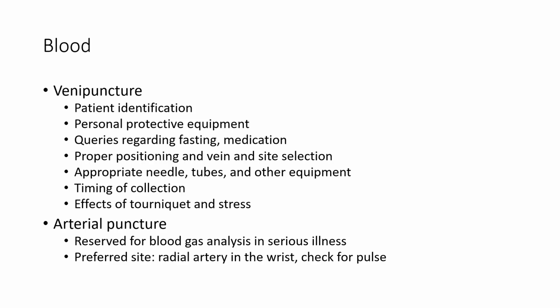Appropriate needle, tubes, and other equipment. The timing of the collection, which is something that I talked about, time of day, even time since the incident is important. And then the effects of the tourniquet and stress. So if the patient is extremely stressed, or if the tourniquet's on too tight, that may lead to some possible hemolysis, some stress hormones that may cause interference, and so forth.